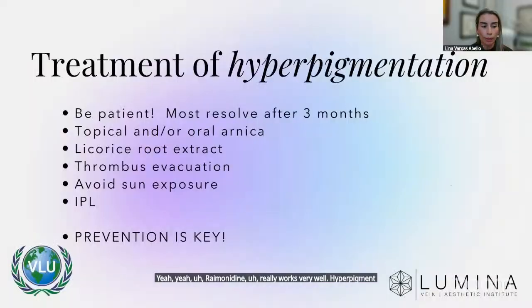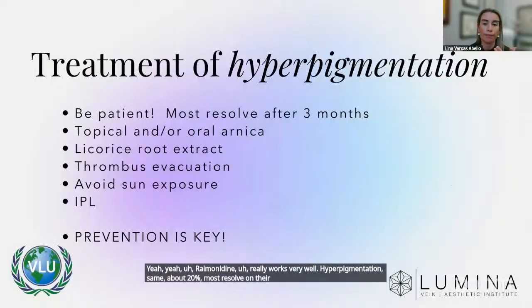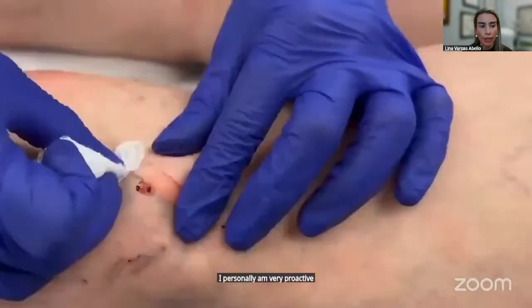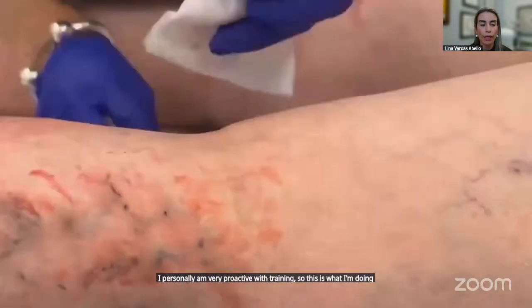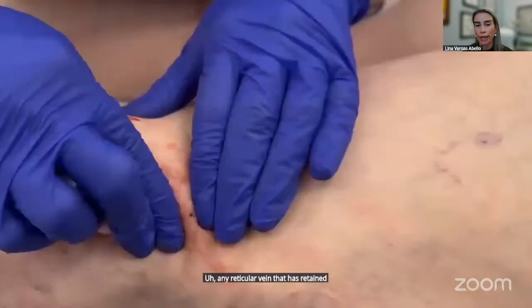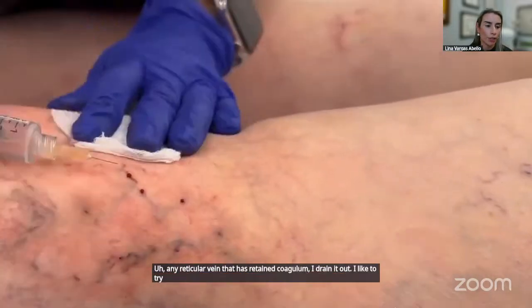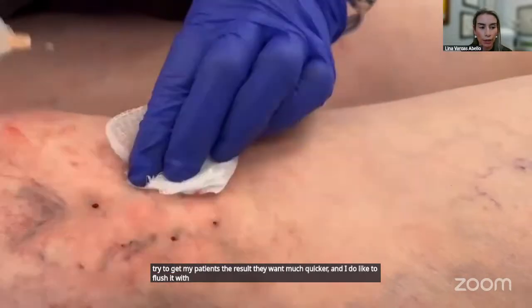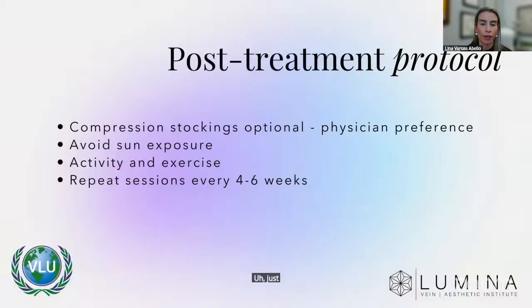Hyperpigmentation, same, about 20%. Most resolve on their own, but the most important thing is just prevention, having good technique. I personally am very proactive with draining, so this is what I'm doing here really quickly. Any reticular vein that has retained coagulum, I drain it out. I like to try to get my patients the result they want much quicker, and I do like to flush it with some saline, just to try to get some of that clot out.